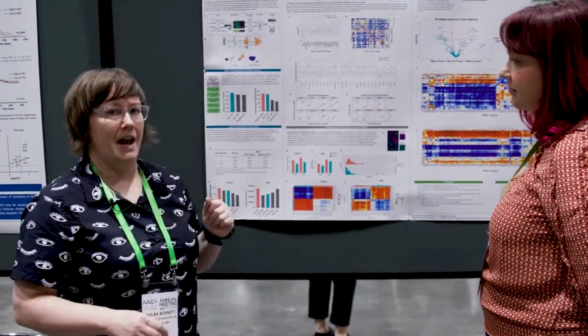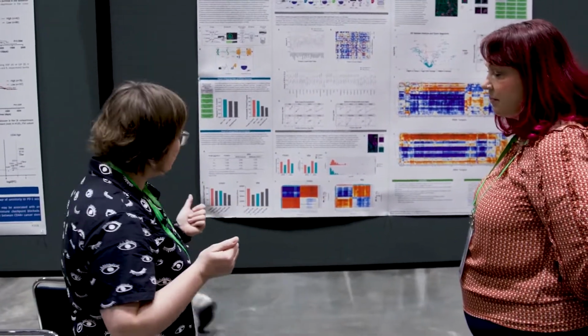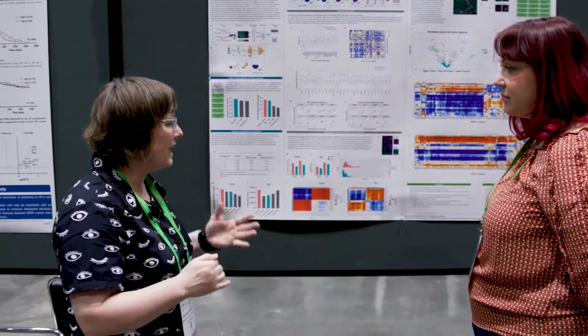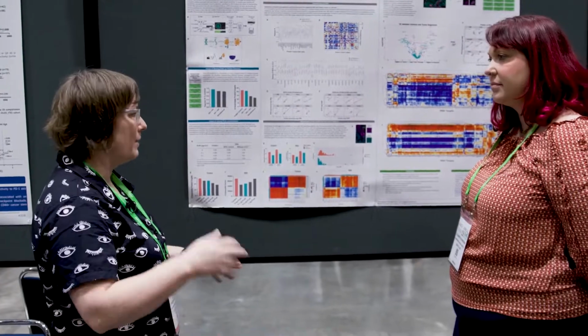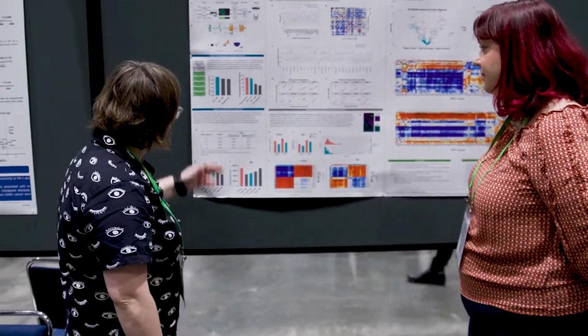The second issue at hand was proteinase K. It's ideal, or it's required, for optimum RNA detection, but it's a protease, so it's going to chew up your protein target. And so we needed to find that happy medium: what was going to make the RNA happy and what wasn't going to make the protein upset. So that's what we did here.